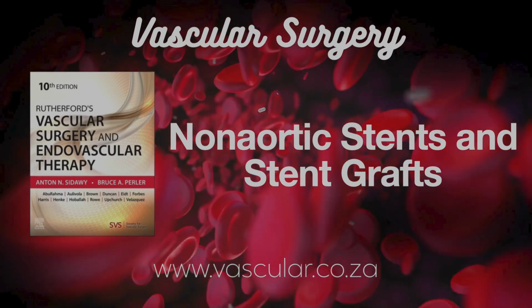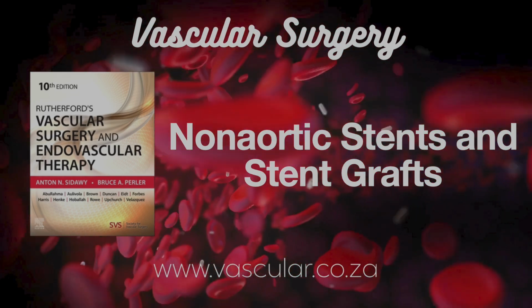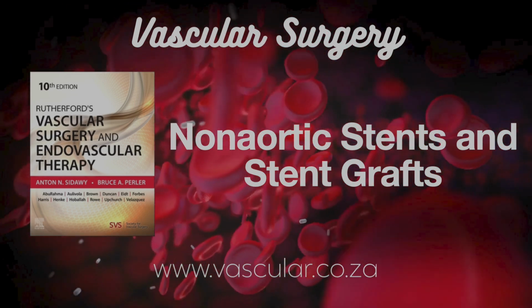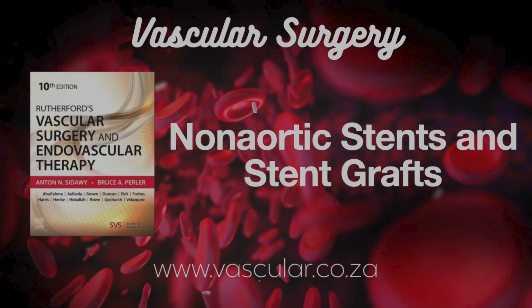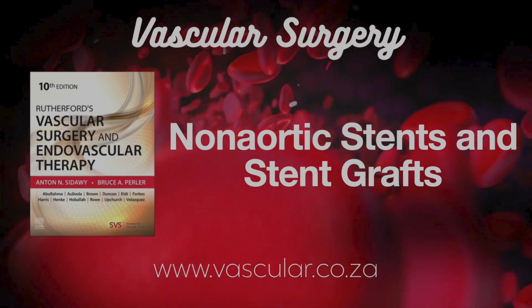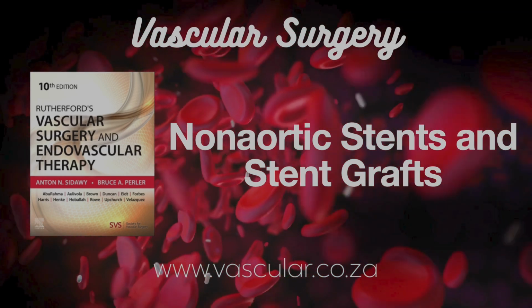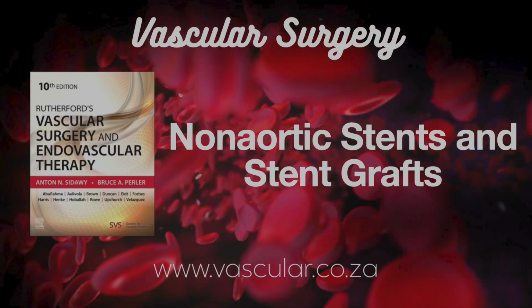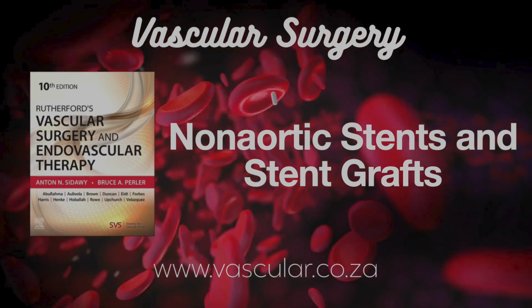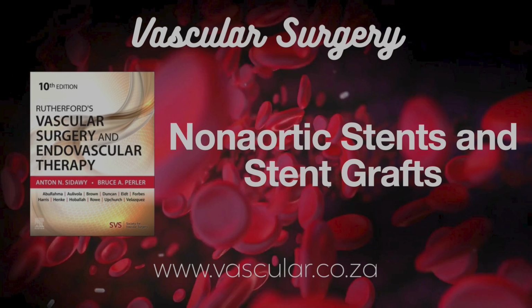If you oversize the stent too much, expand it beyond the natural vessel diameter, you create pockets where the flow is sluggish near the wall. Models showed that overexpanding by just 20% could massively increase the area exposed to low WSS compared to, say, 10% oversizing. So that's why surgeons aim for that specific 10% oversizing in the legs. Yeah, it's a balancing act. Precisely. Enough expansion for good placement, but not so much that you mess up the shear stress too badly.